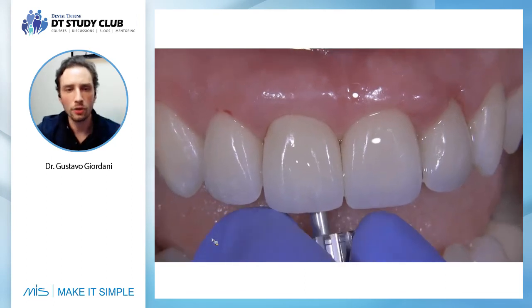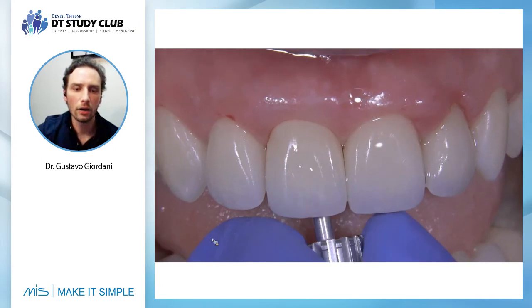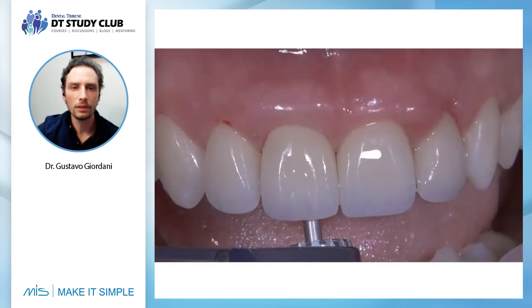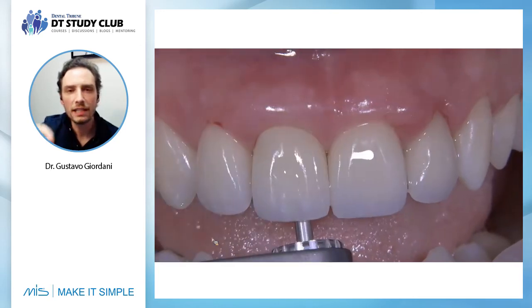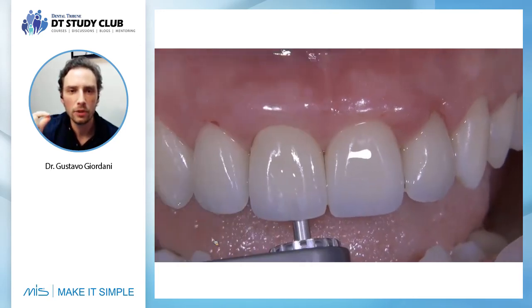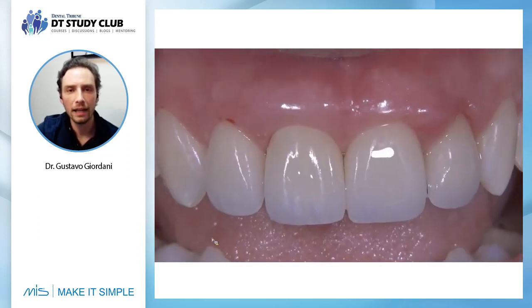Now it's time to remove the rubber dam and to have our final implant restoration torqued inside the mouth. When you use the easy abutment that we use from MIS, you cannot torque more than 20 newtons.